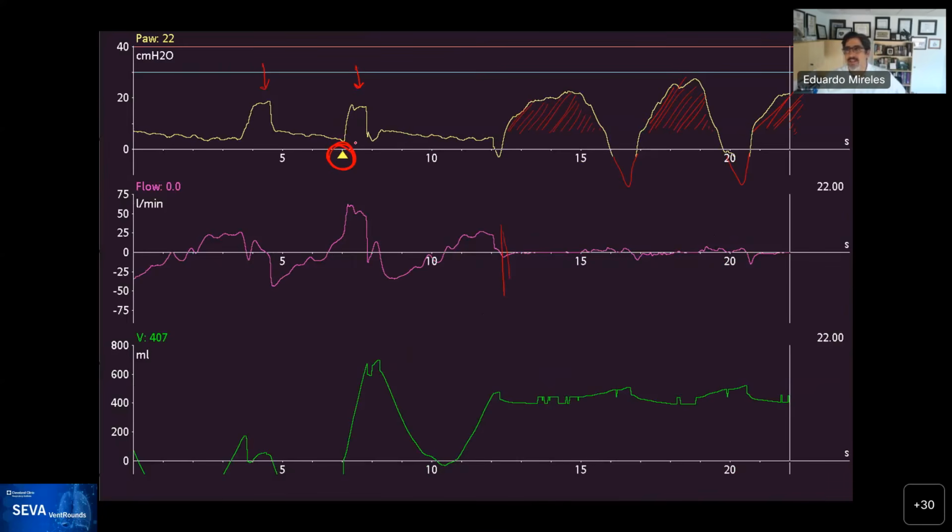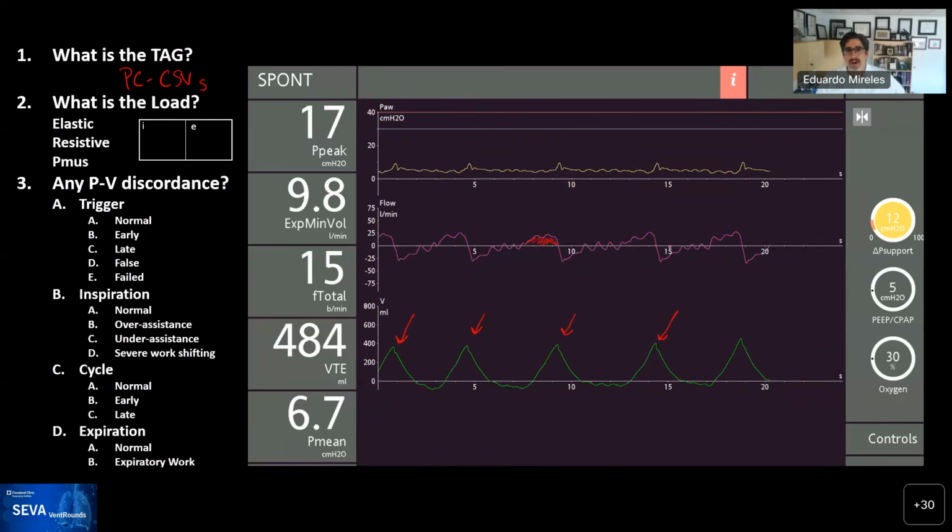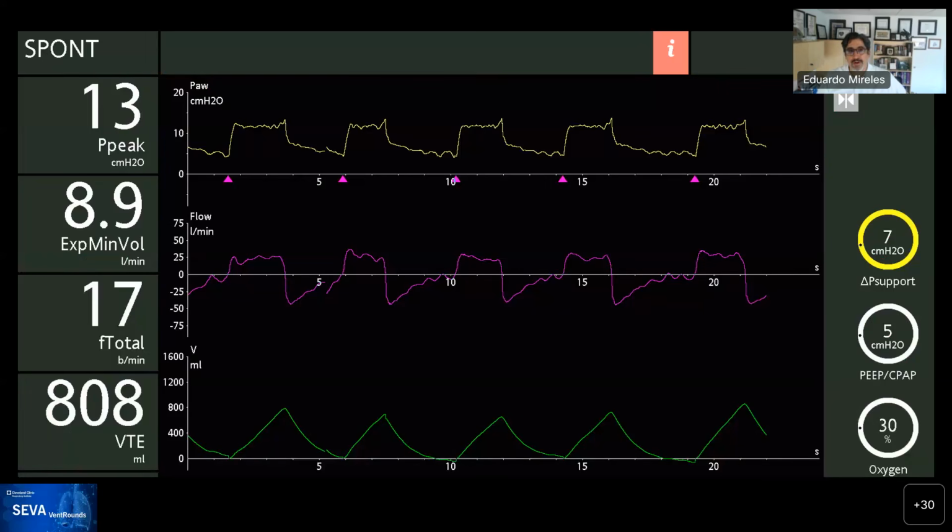The patient gets the breath in and then exhales, and the patient has a long inspiratory effort, but you can see much better how the patient exhales. So this was a case in which I presume that somebody overnight was trying to fight the false triggering from the cardiac oscillations, and this led to a very high pressure trigger that was not triggering the ventilator. And now I can show you here, after we did that, the patient stopped bearing down. So now you can see, again, an occlusion pressure.